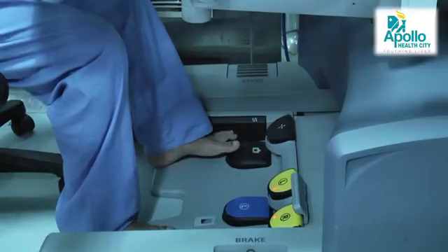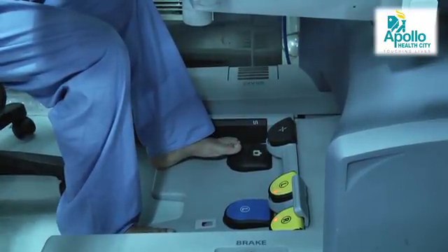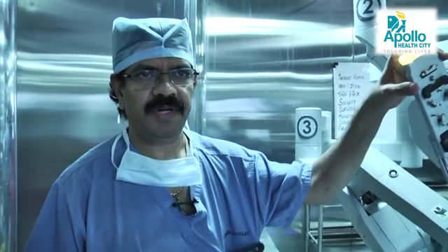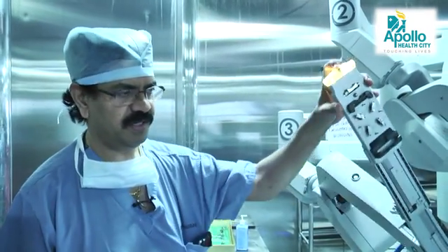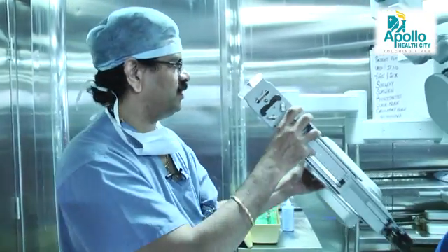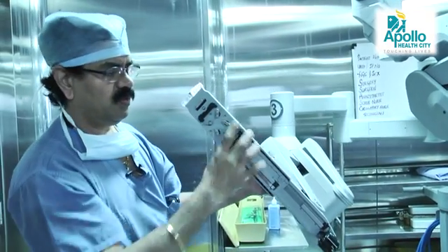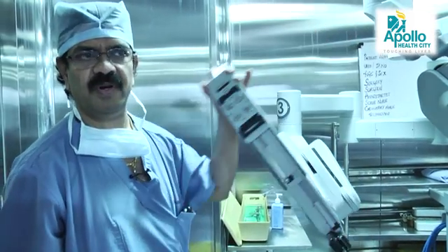It is a lever — like a gear — where a small tap switches from one arm to another. As I mentioned, the robotic arm has a multi-hinged joint. It can be moved in this direction, in that direction, and with the clutch control it can be moved from side to side and up and down. All the desired movements can be performed with this robot.